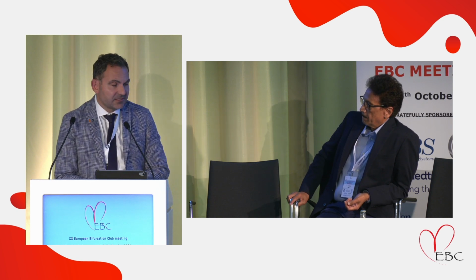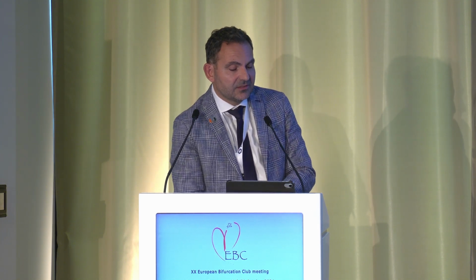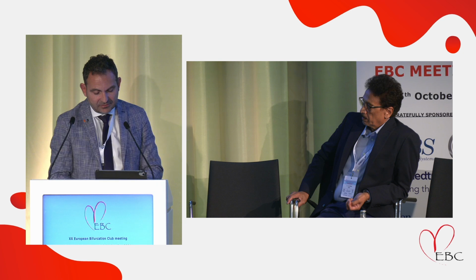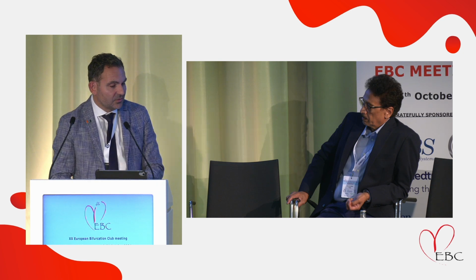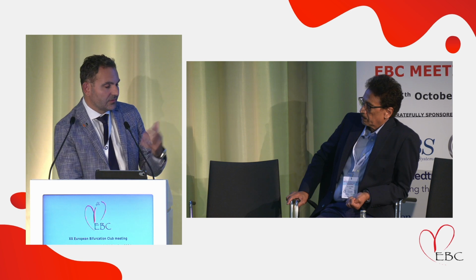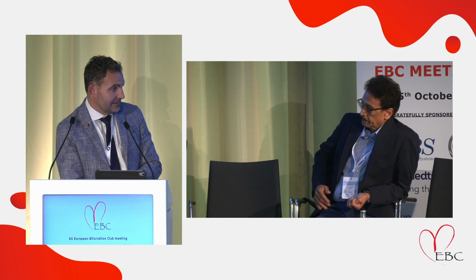High definition IVUS at this point has the spatial resolution, which is comparable, not as good as the OCT, but has the ability to give us high resolution imaging of the struts. You can see here that we can segment the struts and create the stents in 3D. So HD IVUS has the ability to help us a lot, equally with OCT. Plus, it gives us depth of the plaque, which we don't get with OCT. And it's more advantageous in ostial lesions, and of course, when patients do not have capacity for contrast. But of course, OCT is the benchmark, the gold standard.